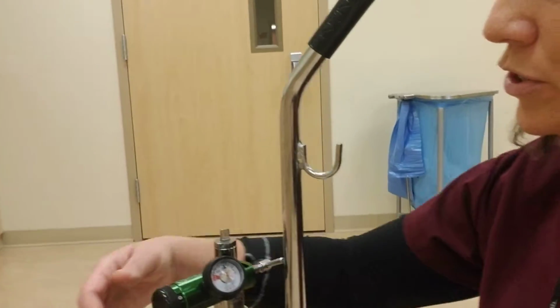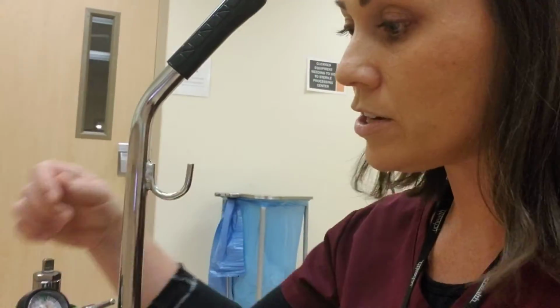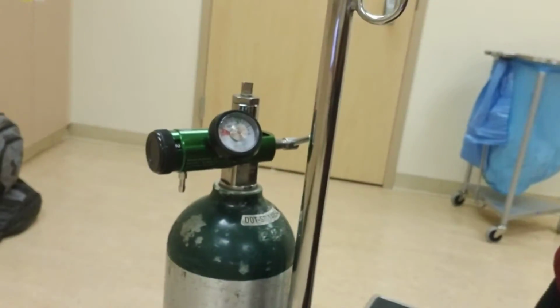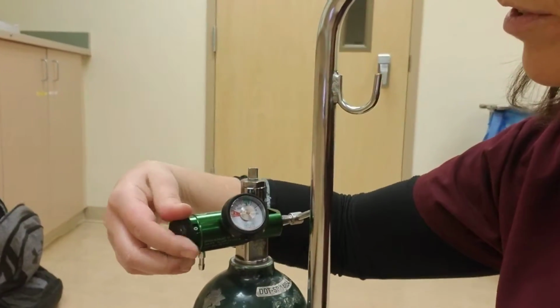So I'll show you here. We'll go ahead and connect your nasal cannula here. We'll hook that onto you and then bump it up to 2. You can see that it's flowing properly. All right, you can shut it off, the flow meter there.